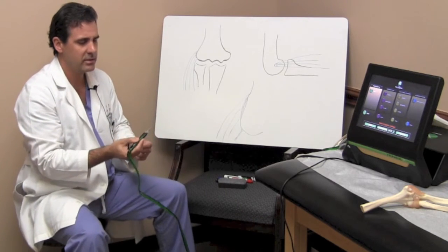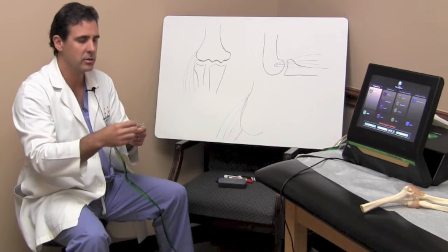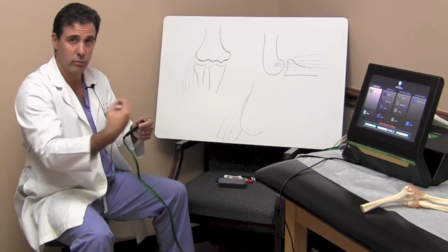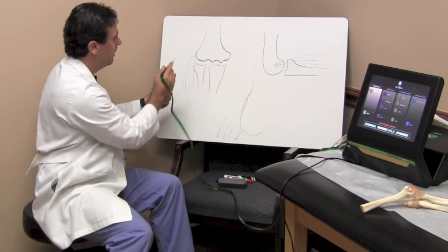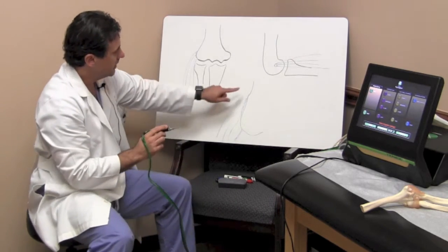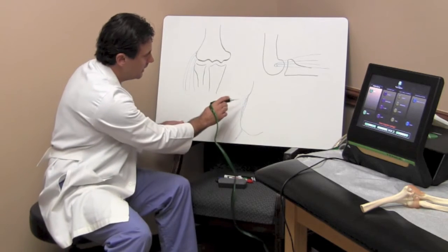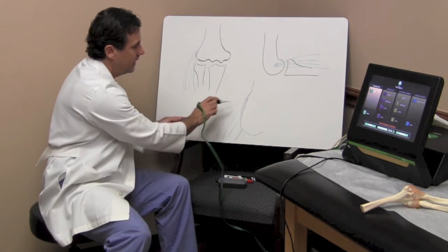The beauty of this device is that it not only debrides the degenerative tissue, but it also irrigates it and sucks it out, so it removes it at the same time at that site. We evaluate it in ultrasound, and we debride that whole area. This here is a larger picture showing you the tendinous insertion. This is the capitellum or the lateral epicondyle. Once again, that degenerative tissue is right here. With the needle, we go in and debride extensively.